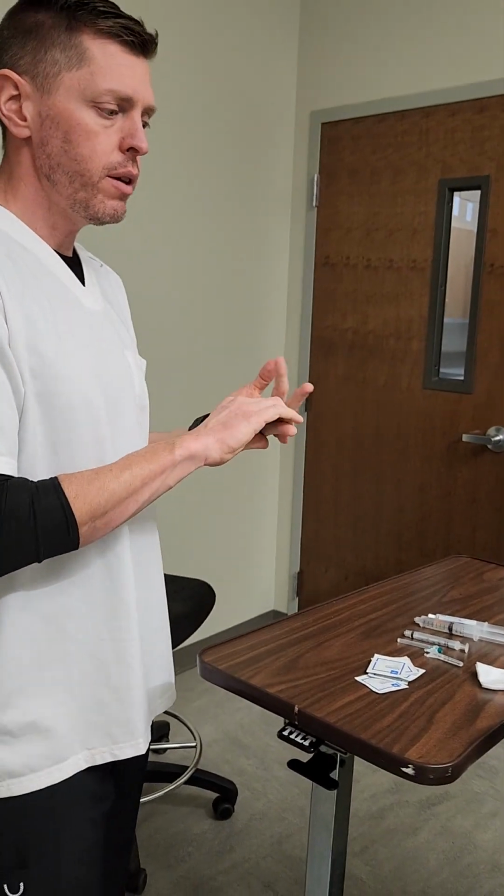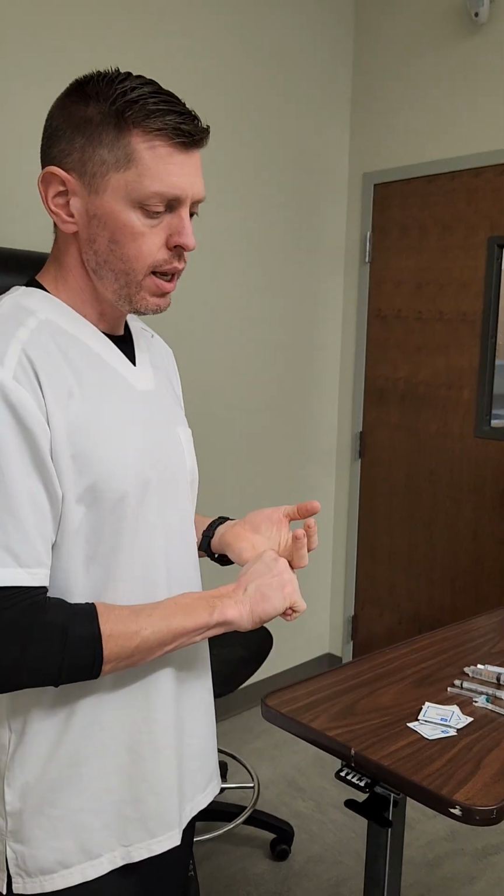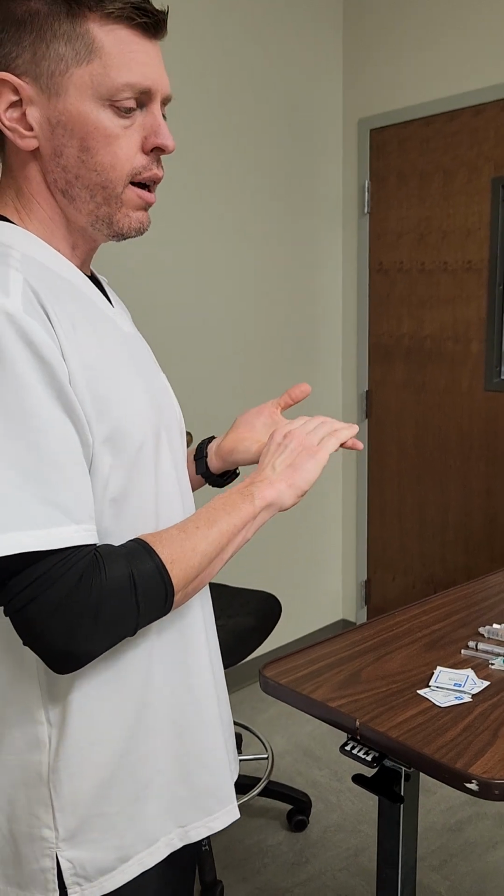I know what the medication is according to the MAR, which I'm going to be verifying quite a few times, and then I know the dosage according to the order. Let's see, I've got the indication. They are in a lot of pain. Let's see, there's patient, medication, indication, and how much. According to the doctor's order, I'm going to give you 2 milliliters of our good old painkiller here.